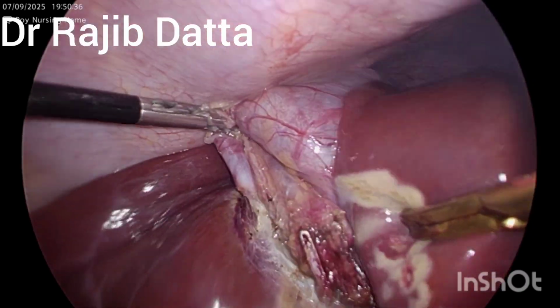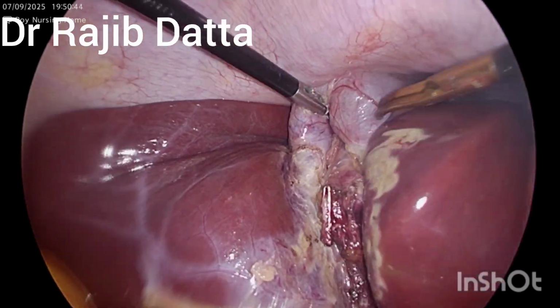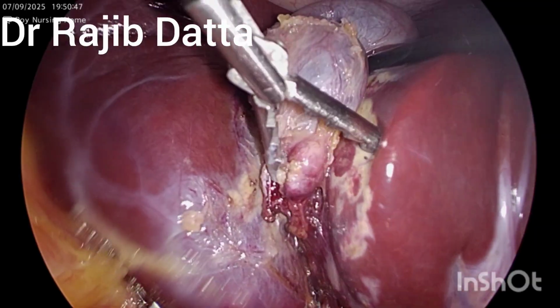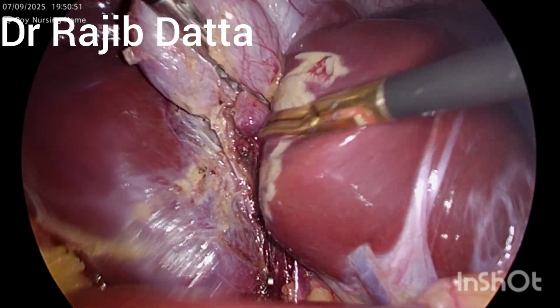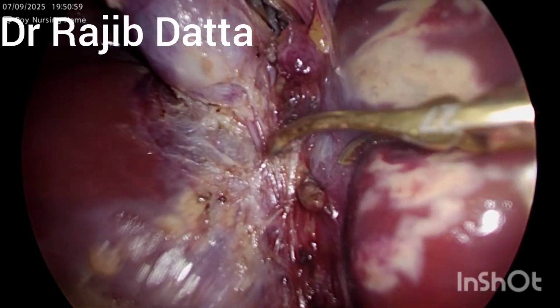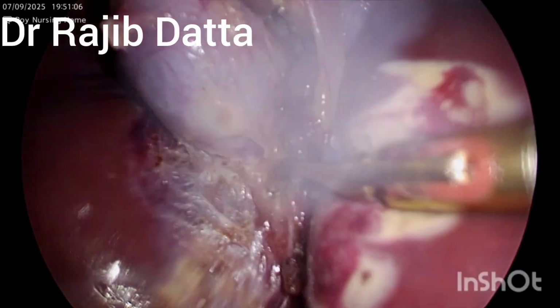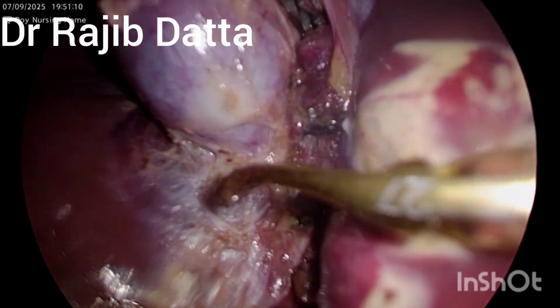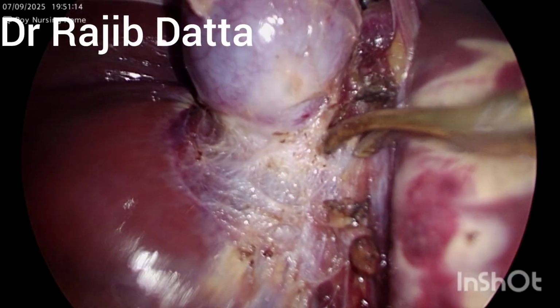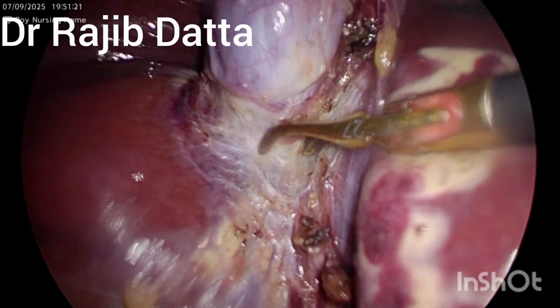and now our job is separation of the gallbladder from the liver bed, which is again an embryological plane, and I am going to separate it. It is a 3-port cholecystectomy, so I constantly change my traction and counter traction in such a way that the gallbladder fossa can be well visualized.